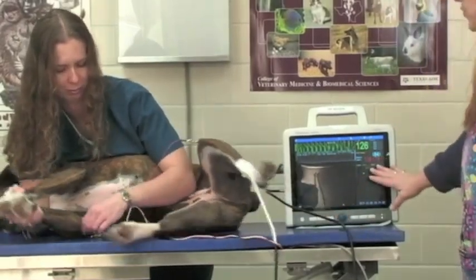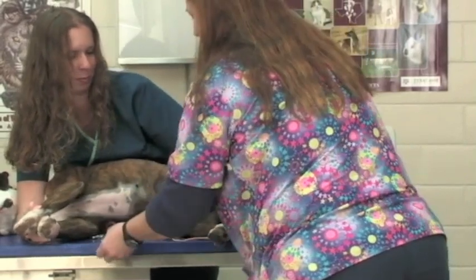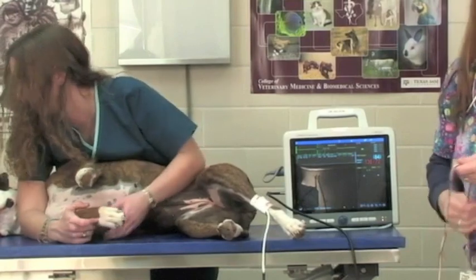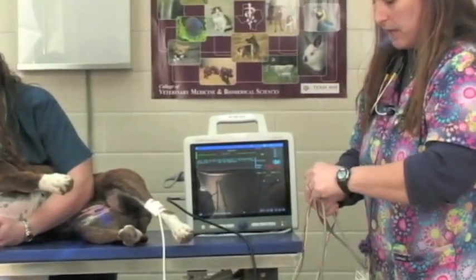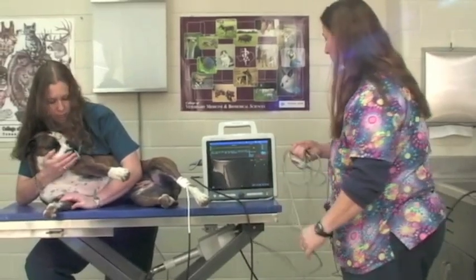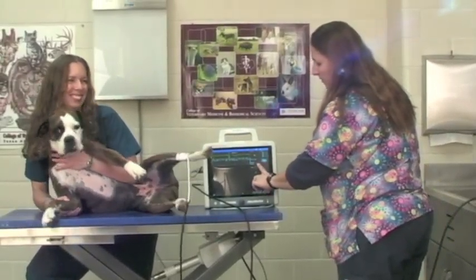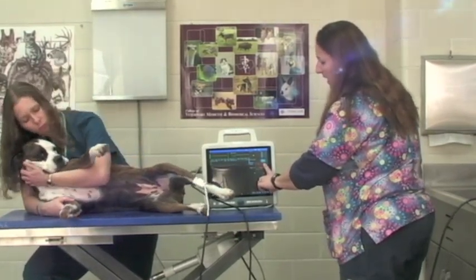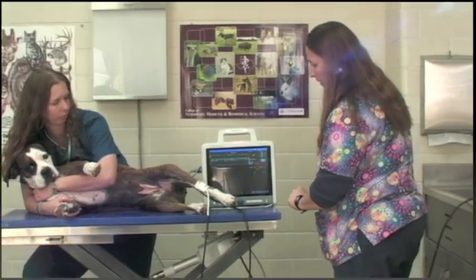We normally actually will take 3 blood pressures so that, just taking one blood pressure, it gives us an idea, but we want to take 3 and we want to compare them to make sure that they're all very similar, okay? On our blood pressure, this very first number is going to be your systolic blood pressure. This is your diastolic, and this is your mean arterial pressure right here, this top number, okay?